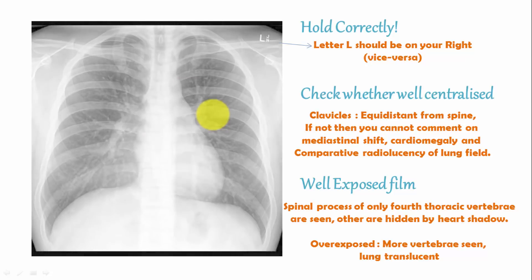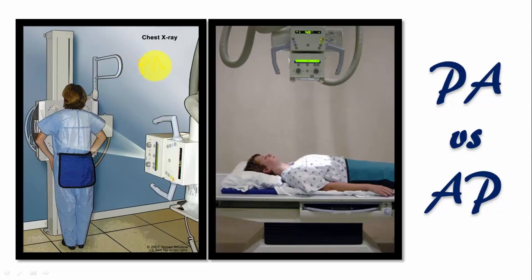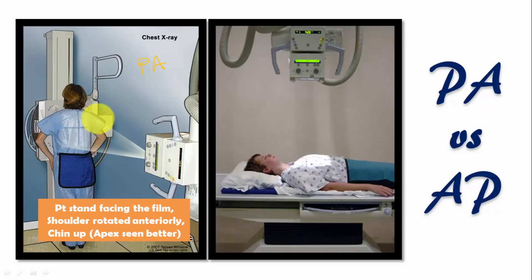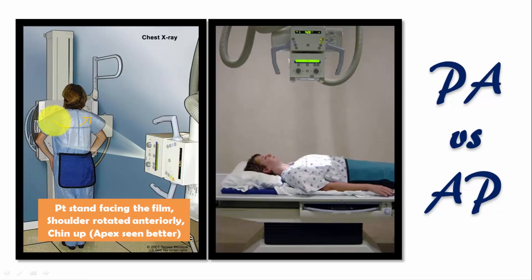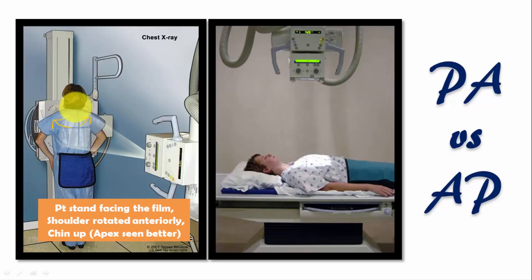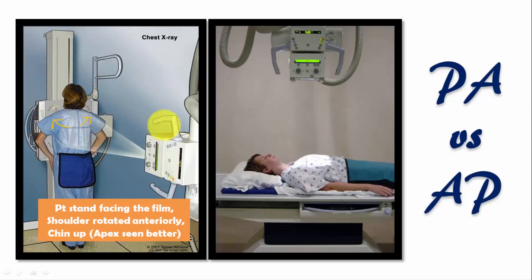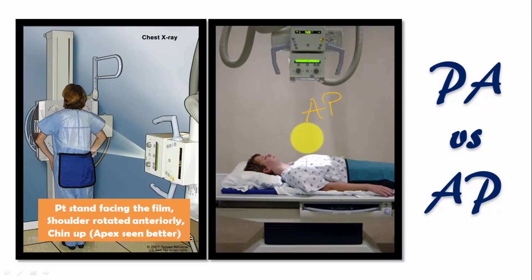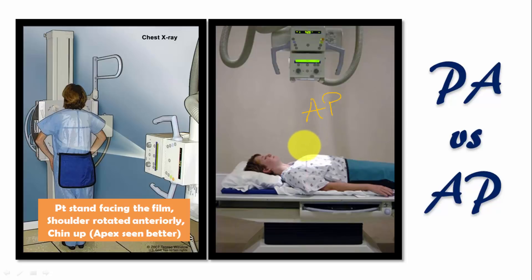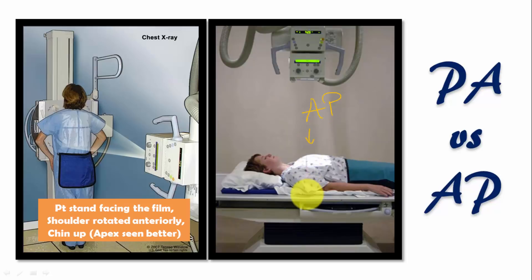Now let's look at the difference between PA view and AP view. In the PA (posterior-anterior) view, the patient is standing in front of the X-ray film, the beams pass from posterior to anterior, the patient has rotated their shoulders anteriorly, and the chin is turned upward to better visualize the apex of the lung. The AP view is usually taken when the patient cannot visit the radiology department, is admitted in the ICU, or is debilitated — here the patient is lying down and the beam falls from anterior to posterior.